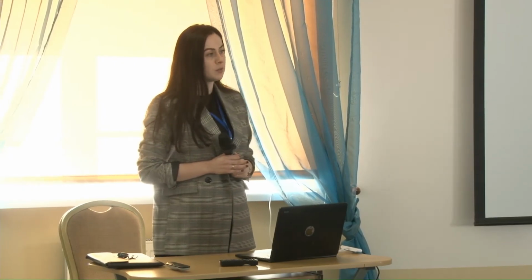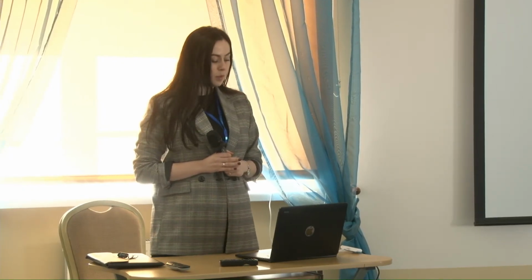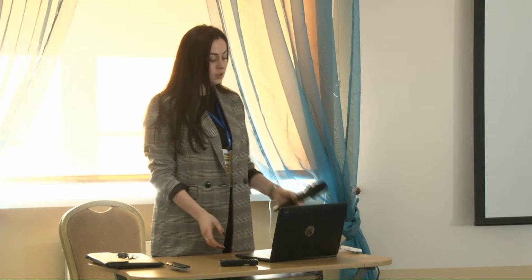My name is Ariadna Polichuk and I represent Omega Kyiv Medical Group. And the topic of my presentation is CT volumetry of the liver.